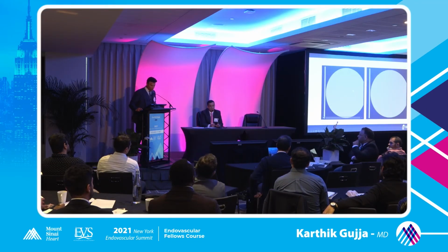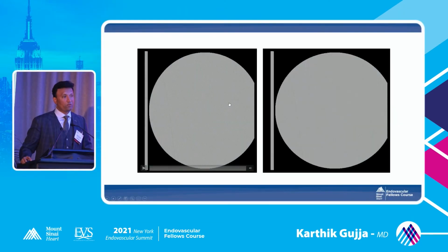Like directional? Yes, it does. So I get this question a lot. I don't think it matters. It depends on the amount of time you're going to atherectomize, how aggressively you atherectomize, and your purpose of atherectomy. Some people atherectomize for lesion modification. Some people atherectomize to get a good luminal gain. So it depends on the reason for your atherectomy. If you're atherectomizing just to get lesion modification so that you can balloon stent it, then no. But if you're atherectomizing like us, we do it to get luminal gain, because we want to do a DCB. We want to get as much luminal gain as possible. So we use larger devices.